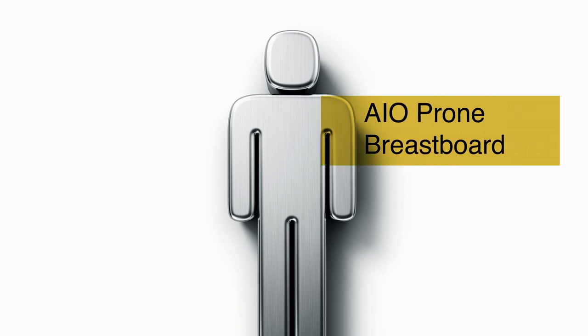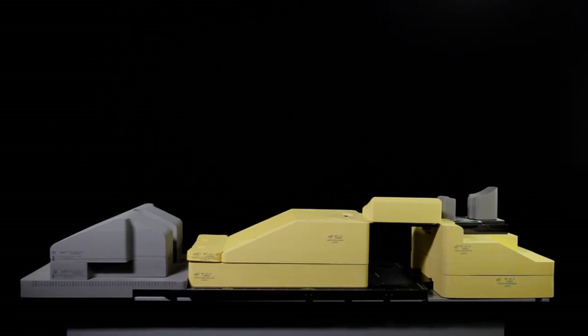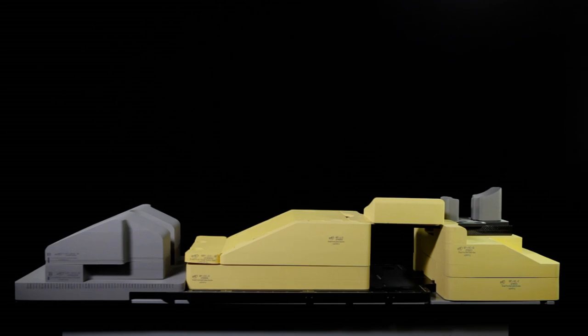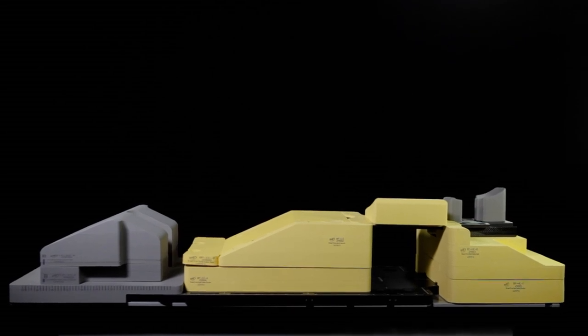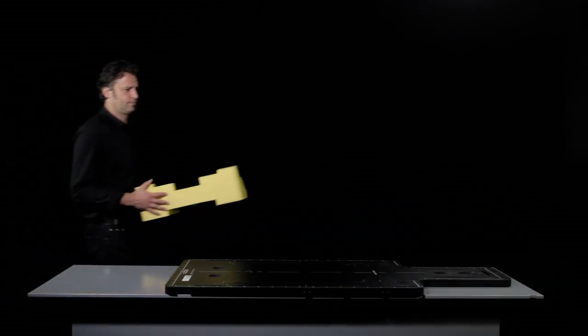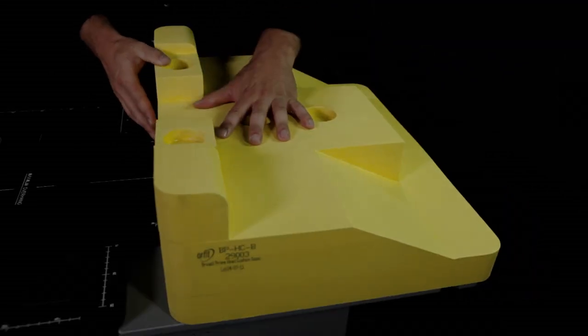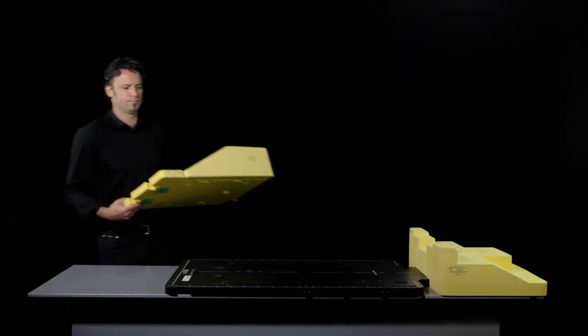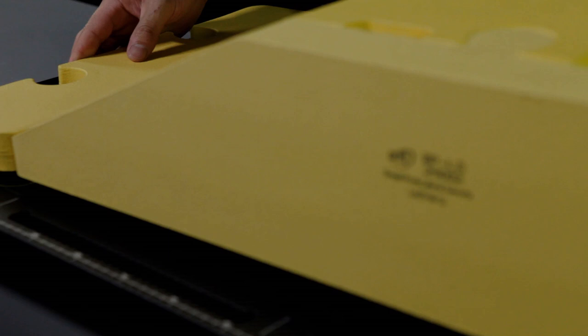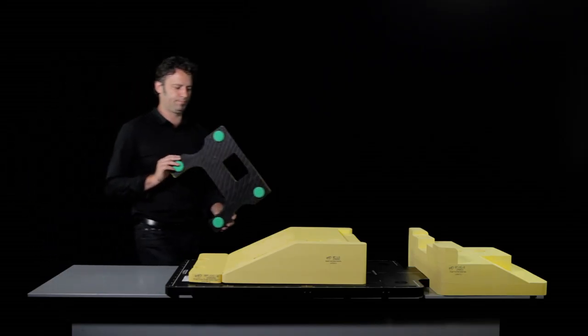AIO prone breast board. The prone breast set is based on a caudal and cranial cushion with a gap in the middle. First put the cranial cushion in place by locating the bosses underneath the cushion in the base plate. Push them well in. Then put the caudal cushion in place. The yellow lines on the base plate will help you find the right place for these cushions.